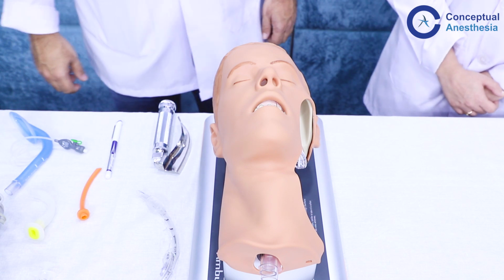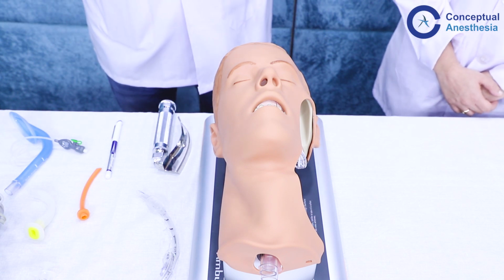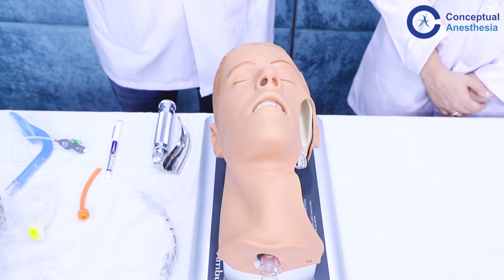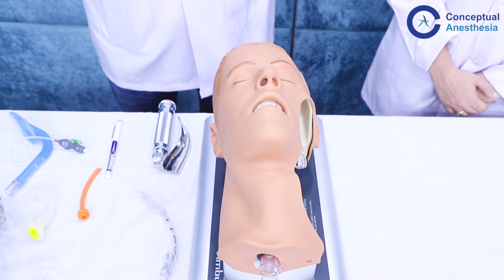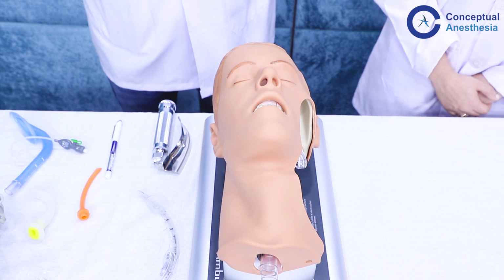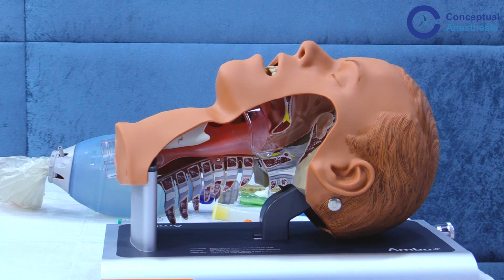So we are going to start with the situation in the operation theatre. Now this is our patient who is posted for an abdominal surgery. I have given him IV anesthetic agents. So I have induced him with fentanyl 2 mics per kg as an opioid, IV induction agent propofol 2 mg per kg and muscle relaxant has been given. Here, since I am not anticipating a difficult airway in him, I have given rocuronium to this patient for muscle paralysis.